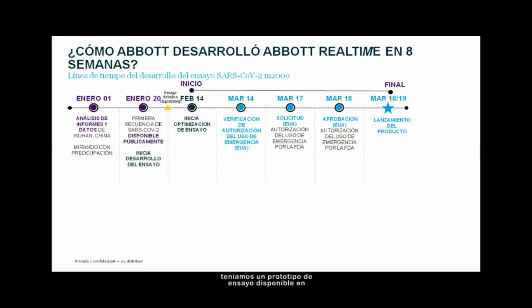And we had a prototype assay available within days, which, the point I make on March 5th. We developed this with a certain enzyme formulation, and then we realized this would need to be done at scale. It really hit us how much scale would be needed and how fast this would need to be done. So we reformulated with a different enzyme to accommodate this kind of manufacturing.